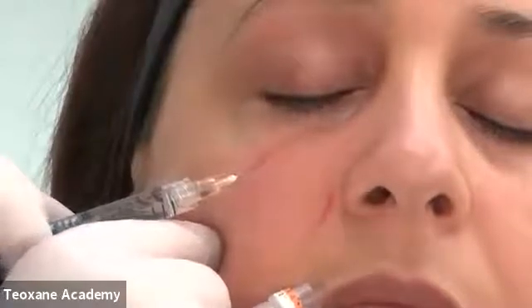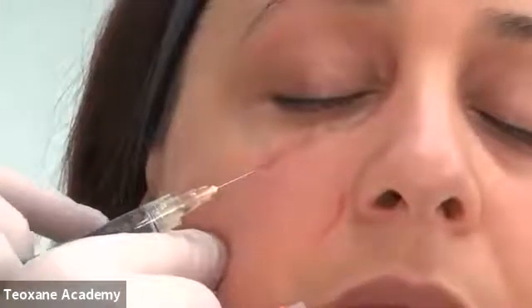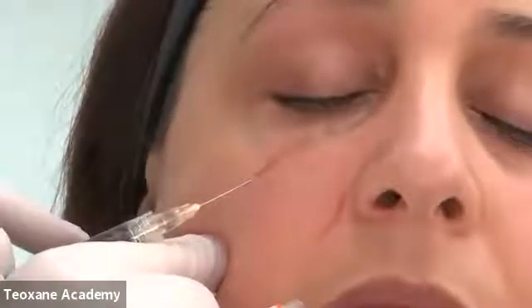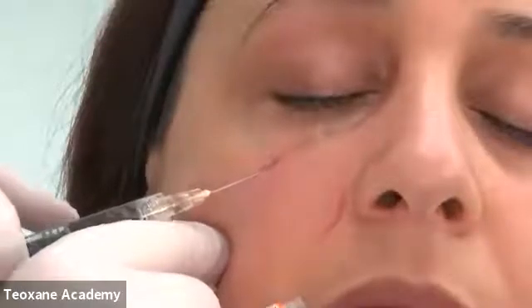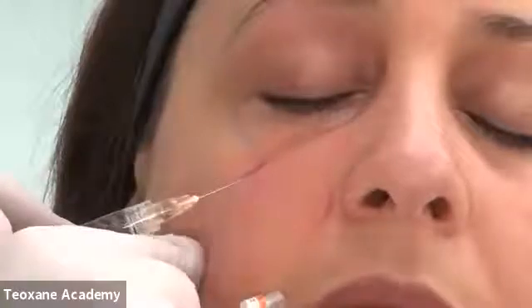and I will go up until I reach the darker area. I don't do any massage, and I will inject my product slowly just to erase, as you can see here, my depression. I put 0.3 ml of product in this depression, and I will just mold a little bit. So if I show you what I did, I will show you in a sitting position, but first I will do the palpebral malar groove, and I will sit my patient.